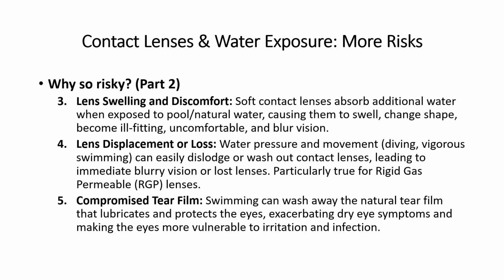Continuing why water exposure is so risky. Thirdly, there's lens swelling and discomfort. Soft contact lenses are designed to absorb water, and when exposed to pool or natural water, they can absorb additional water, causing them to swell, change shape, become ill-fitting and uncomfortable, and even lead to blurred vision.